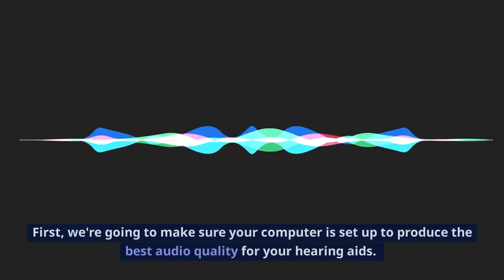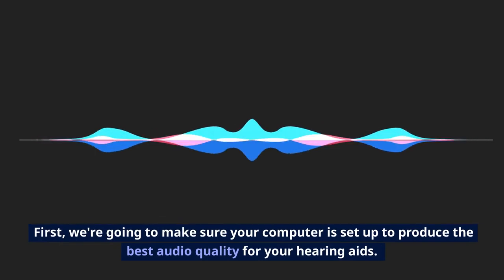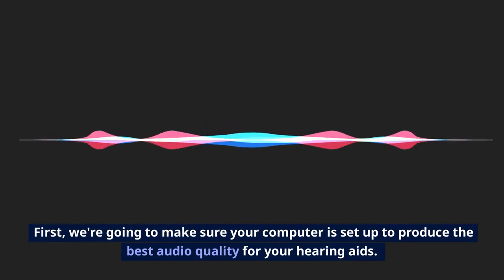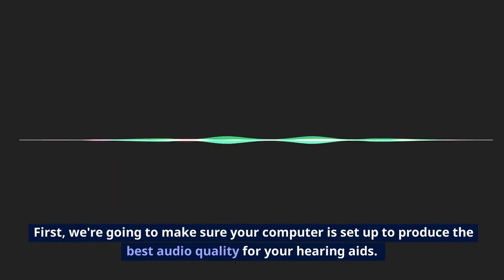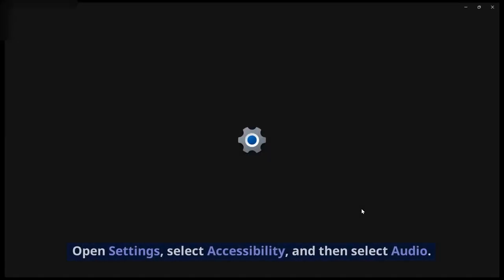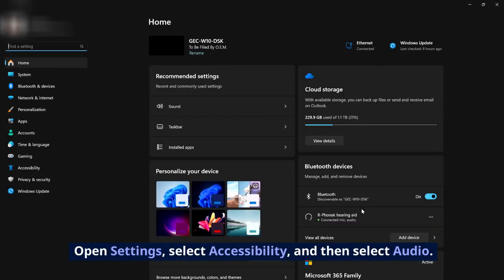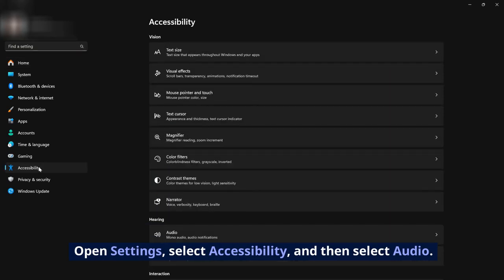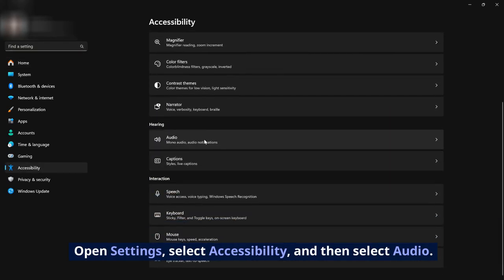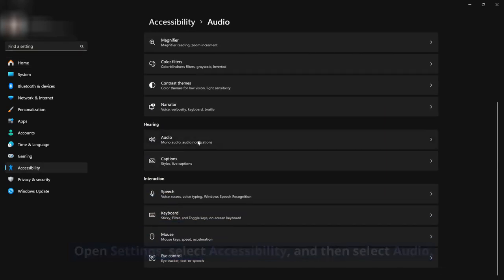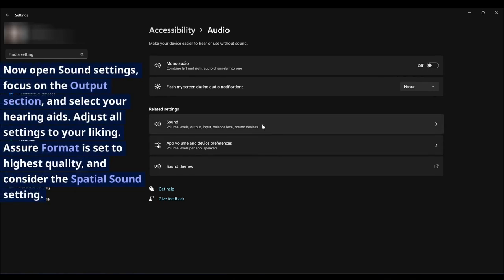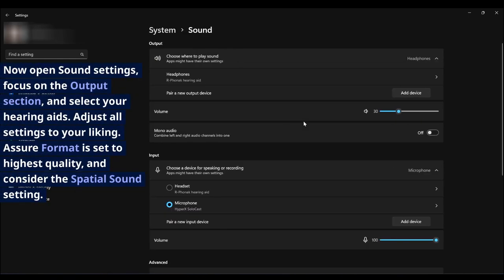First, we're going to make sure your computer is set up to produce the best audio quality for your hearing aids. Open Settings, select Accessibility, and then select Audio. Now open Sound Settings, focus on the Output section, and select your hearing aids.